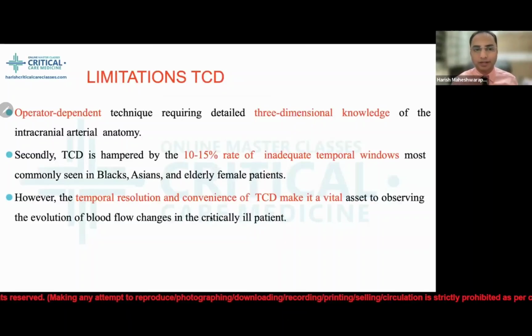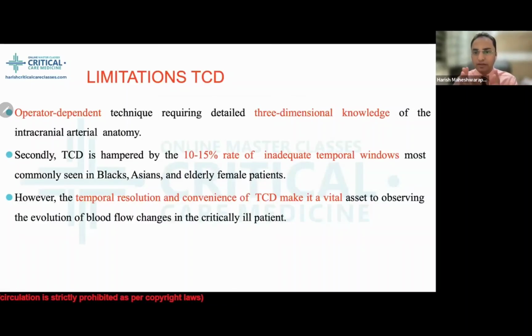But we need to understand certain limitations of TCD. It is operator dependent. The technique requires detailed three-dimensional knowledge of the intracranial arterial anatomy. Secondly, TCD is hampered by the 10 to 15% rate of inadequate temporal window, meaning getting a window is a problem, most commonly seen in blacks, Asians, and elderly female patients.